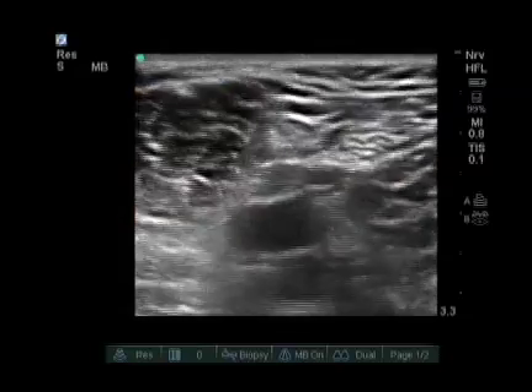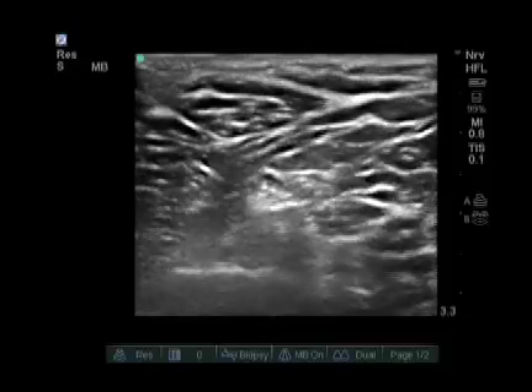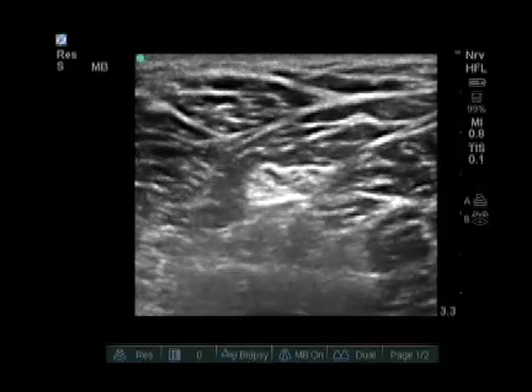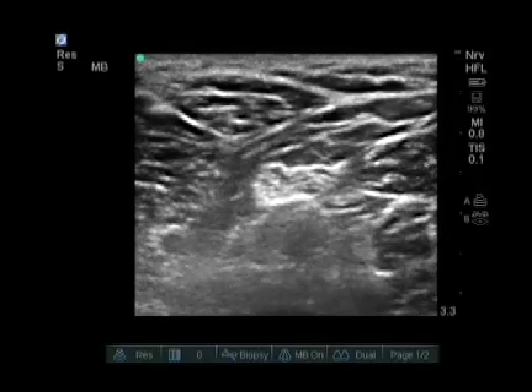As we keep going up the leg, the tibial and peroneal components join into one nerve. Sometimes we block the nerve at this level where the two components are joining. This allows us to get both components with a single injection at the nerve.